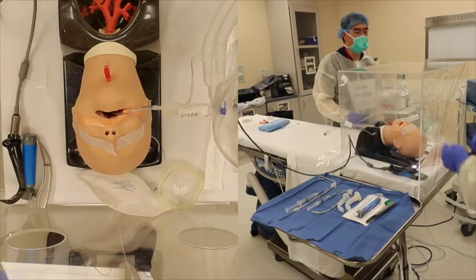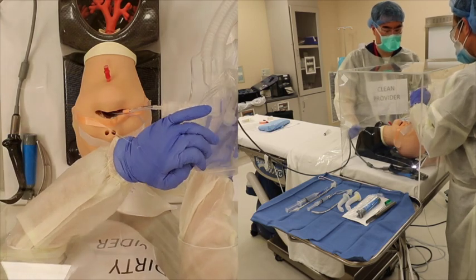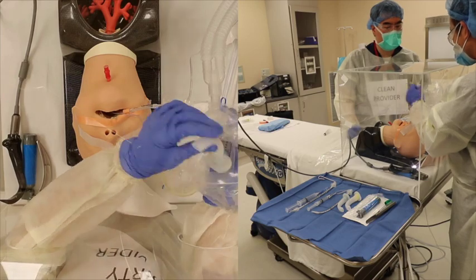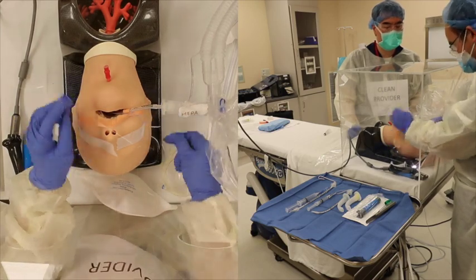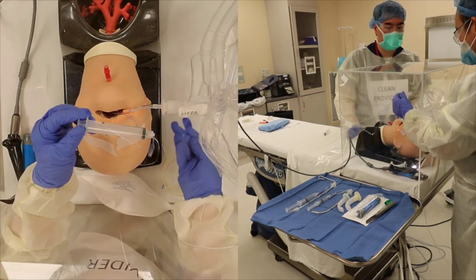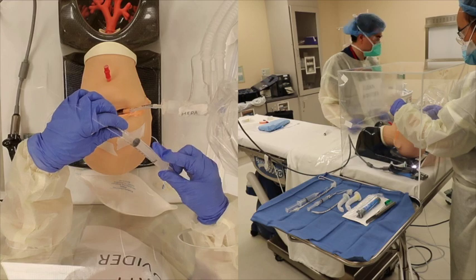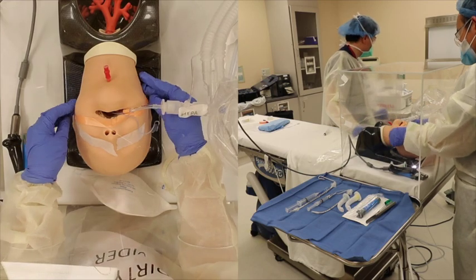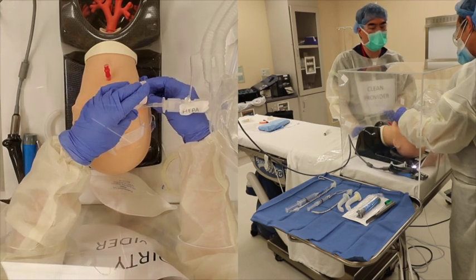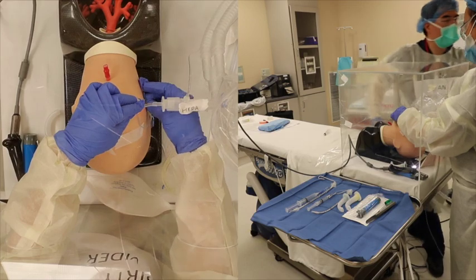For emergence and extubation, a deep extubation is the preferred method. If an awake extubation is required, the goal will be to minimize coughing, emergence delirium, and agitation. If the patient is at risk for self-injury, have additional sedation medication readily available, or consider removing the box prior to extubation with the proper precautions.